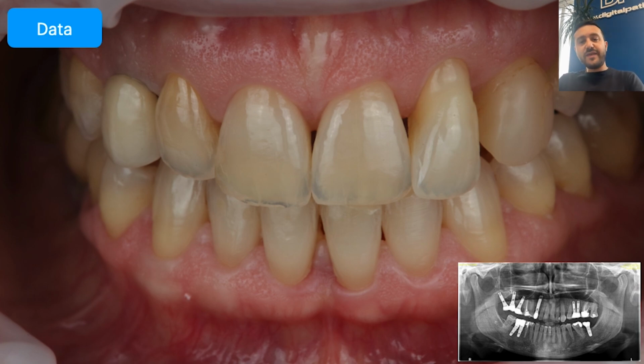We have the X-ray on the right part of the screen, and we've got an implant on tooth 1.3, and an extrusion between 2.2 and 2.3 that was rebuilt with composite. Even from this single photo, we already have quite a bit of information. We can see the challenges, the asymmetries, the materials involved, but is this enough to make a decision? So the truth is, no, it's not.